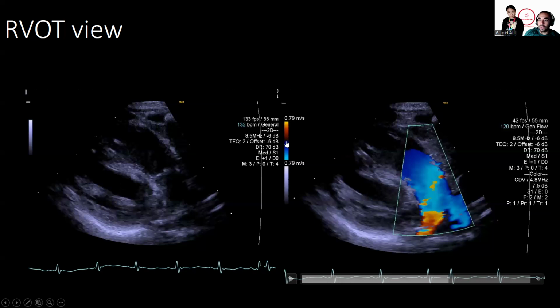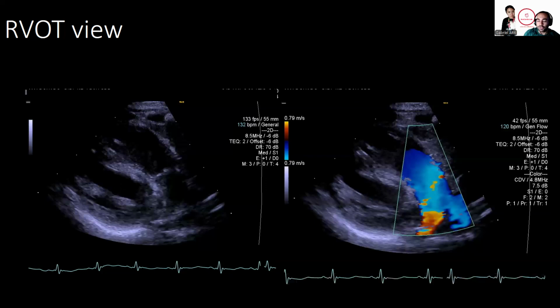If we're starting to see low velocity blood flow, so think about a venous flow, a flow through a PFO, a patent foramen ovale or interatrial shunt, a flow through a coronary, and that's more for cardiology or TNE application, we would use a much lower velocity filter in order to see that flow. The lower the velocity that you go, the more you don't filter out blood flow that goes in different directions, and the more you may get aliasing in certain structures because the machine has difficulty getting you the bulk of what is actually the main directionality of the blood flow.